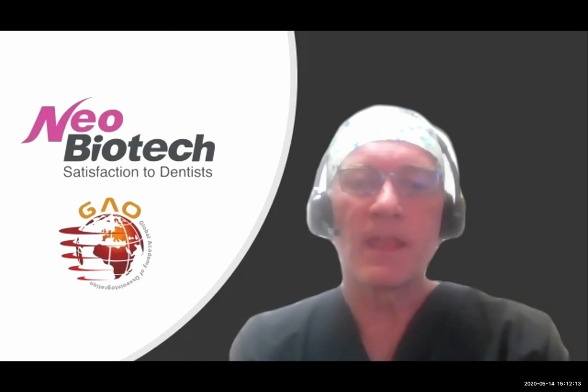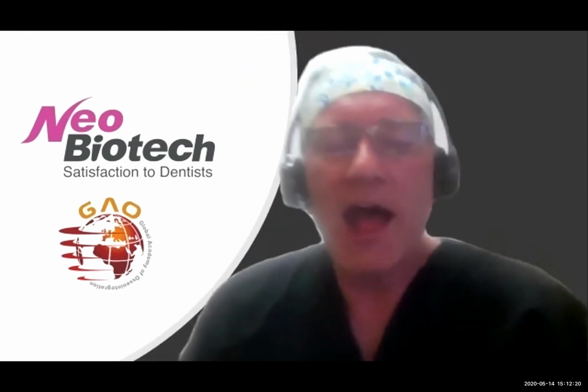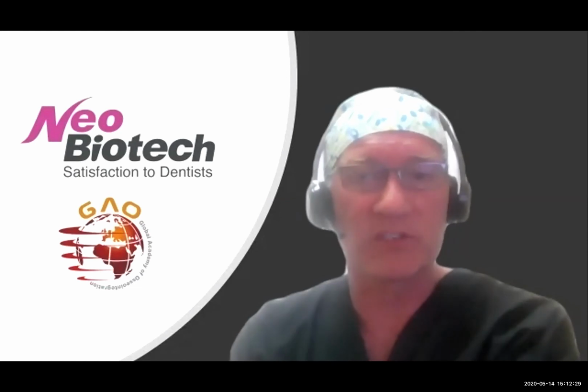We're putting it in a good site, and we've got an area where we're able to grow bone. Next question. When would you use a larger particulate size allograft, like 1,000 or 2,000? So I did that in the beginning steps. When I was doing this for just root coverage, I was using a larger particle size.